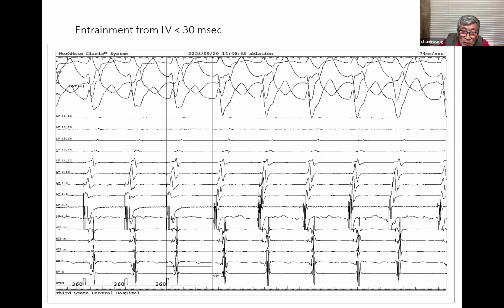Your ablation is pretty close to the same area in most of them, but you really need to know what you're doing, because with the high upper septal form, sometimes you map wrong and end up causing heart block because you're too close to the His bundle. Especially the anterior fascicular form as well. You ablate the left bundle anterior fascicle just a little bit off, not too far from the main left bundle. So I do recommend bringing them back, for the patient's sake.